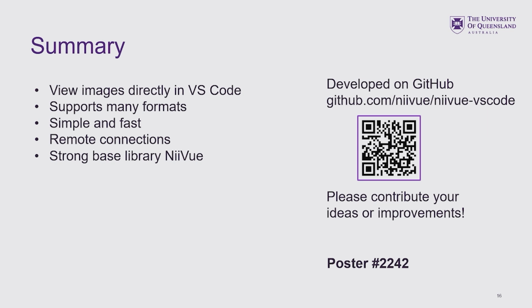Hi, incredible software, well done, and thank you for bringing this. Thank you. I have a technical question. What is the level of compliance with the NIfTI headers, in particular the S-form and Q-form orientation matrices? Is there at least a mode to switch and ignore it and that kind of thing?